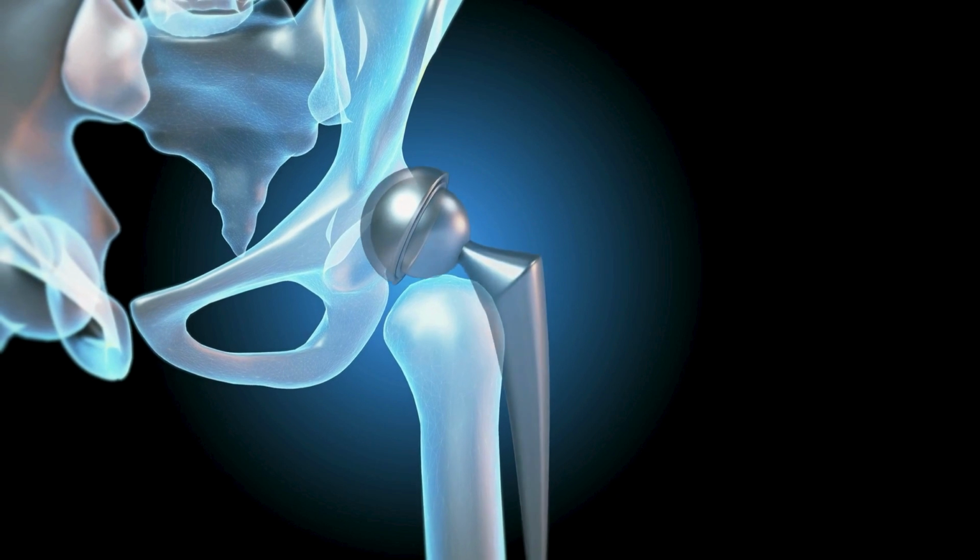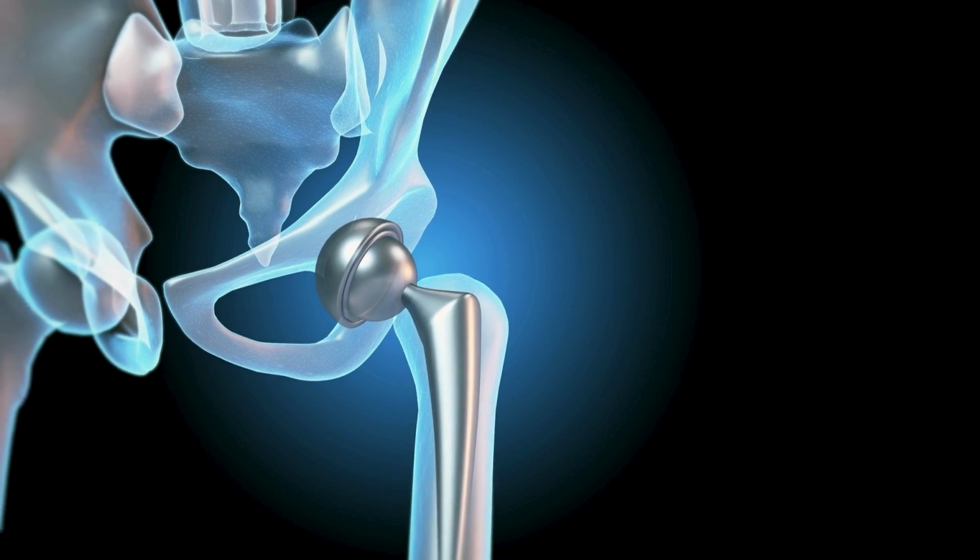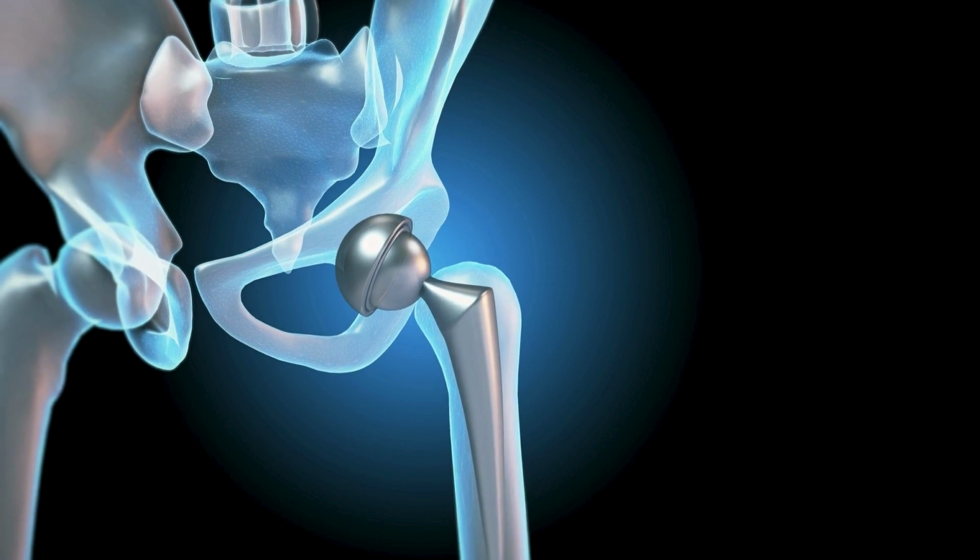And the last group of implants which you routinely use are the ones which replace part of your joint, that is the hip replacement surgeries and knee replacement surgeries. They are called prostheses. This is about the range of implants which you routinely use in orthopedics.